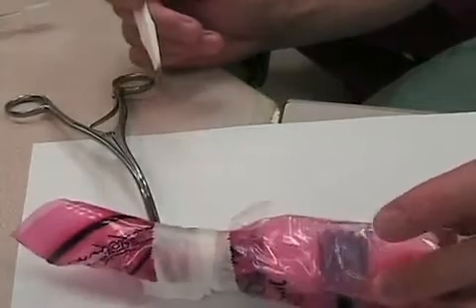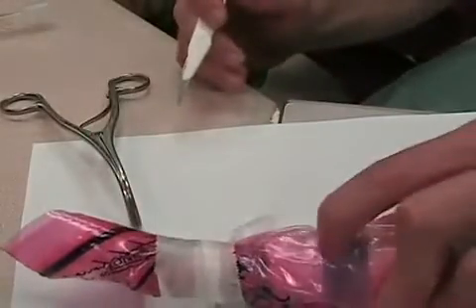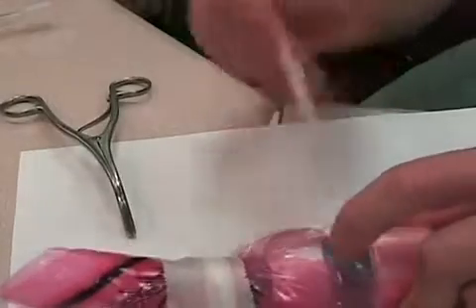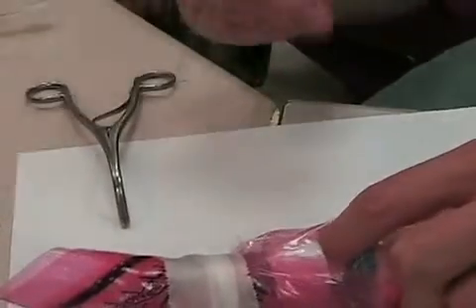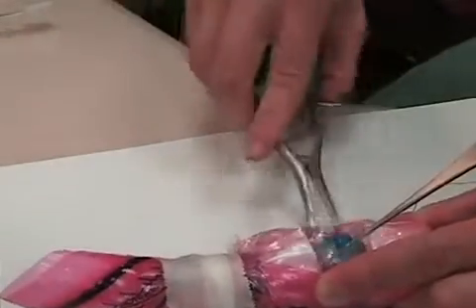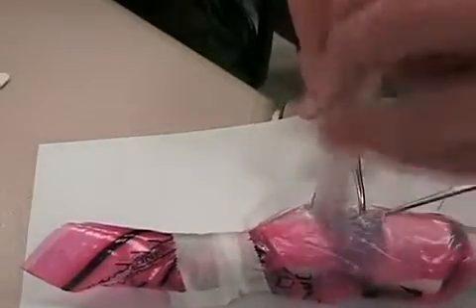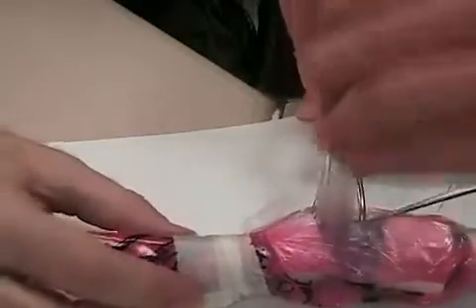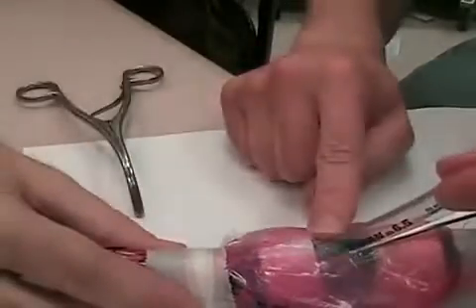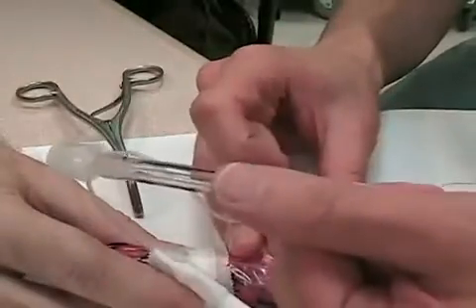Grab onto your thyroid. Feel the membrane. Skin incision. Find the membrane again with your finger. Cut the membrane horizontally. Finger. Hook facing towards the ceiling — hand it off. Dilator. If you don't have a trach, just use an endotracheal tube — same thing. Insert horizontally, not towards the feet, towards the jaws of your trousseau. Rotate the trousseau, rotate your tube, then insert. Don't go any further than when you see the cuff of the tube disappear or you'll be in the right mainstem — you should have a large amount of tube sticking out.